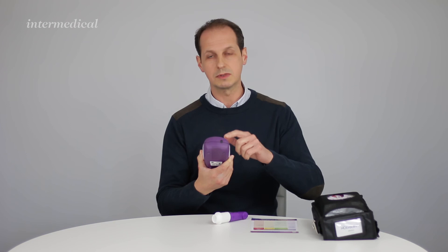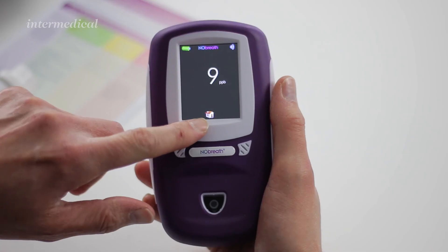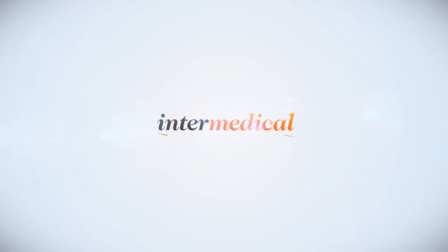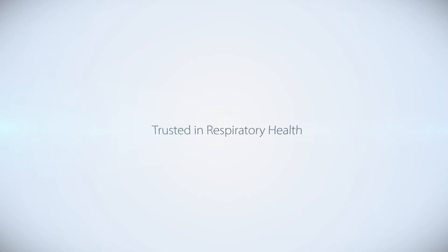Once the reading has been taken, the hourglass will rotate at the bottom of the screen. Once it's ready a symbol will appear — you push the symbol and you'll go back to the home screen, ready to do the next test for the next patient. Thank you so much for joining us.